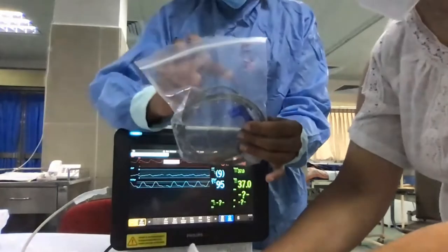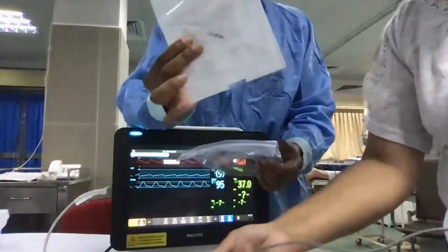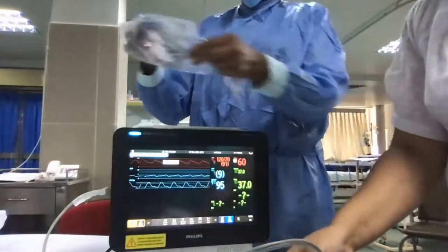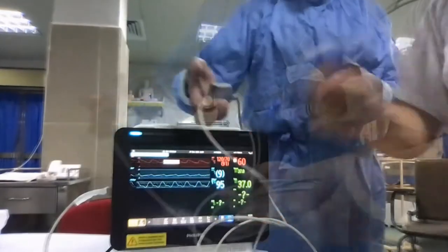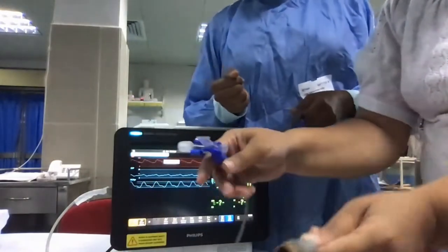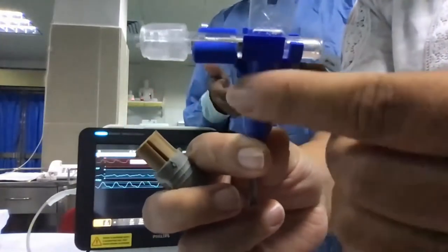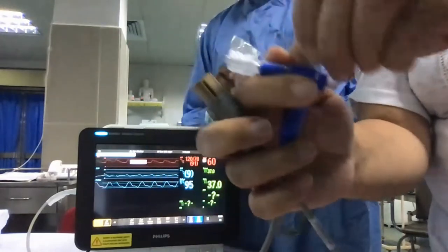This blue color temperature probe gets connected to an injectate housing, a colorless injectate housing like this. I will show you how it gets connected. This is the one we have already connected. So these are the sort of cables that you need. It has two pins on the brown port. And then there is a blue color bit here, which is the thermal sensor, to which we have fixed the injectate housing.